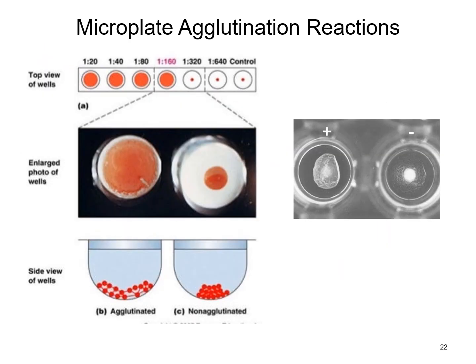All right, let's talk about microplate agglutination reactions. So you can use microplates in a couple of areas of the lab. Primarily, it's going to be blood bank and micro where you're going to really see these types of testing going on. With your microplate reactions, depending on the particular test, you're going to have a plate that has several of these wells in it.